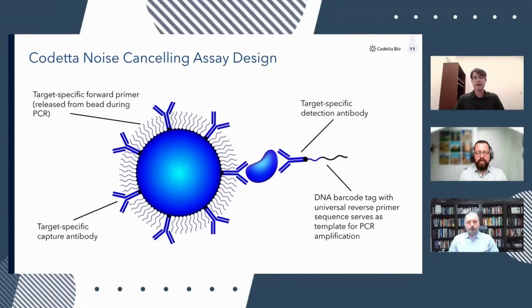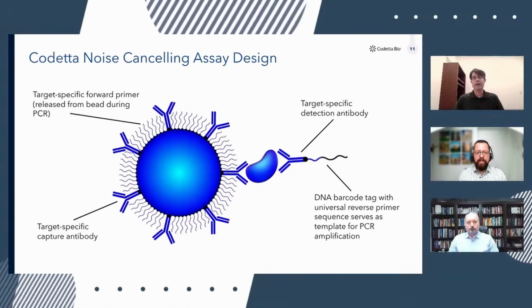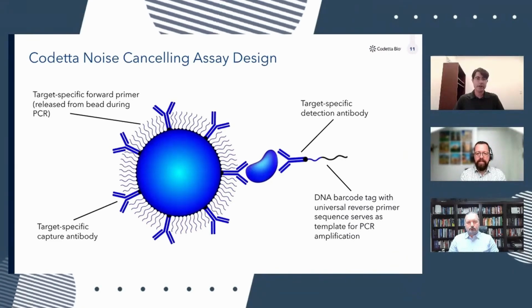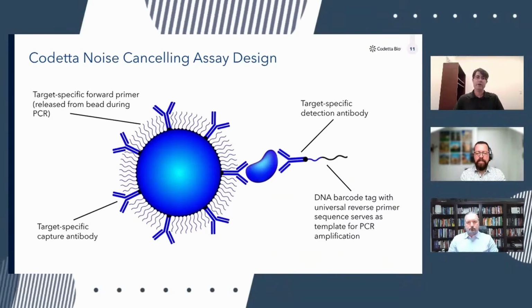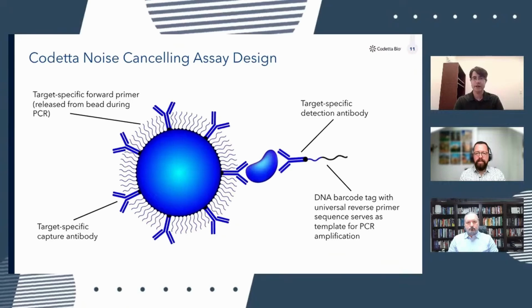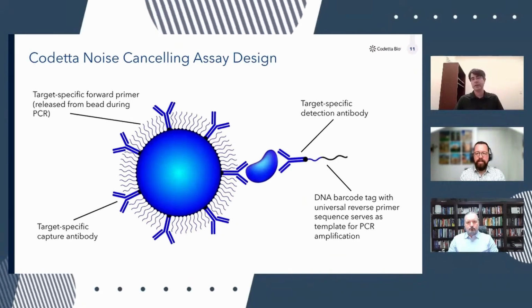In order to mitigate that, Codetta has developed the noise canceling assay approach, where the assay beads are programmed with both a capture antibody for a specific target of interest, as well as a target-specific forward primer. So a short single-stranded DNA PCR primer is also attached to the beads.